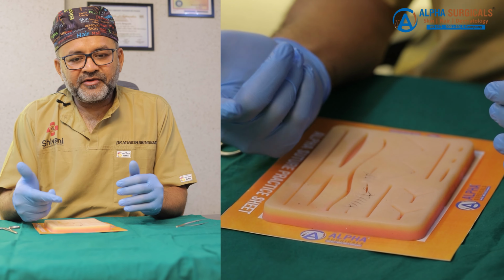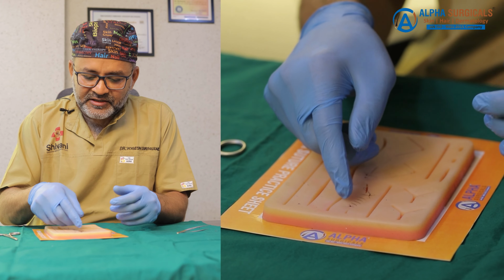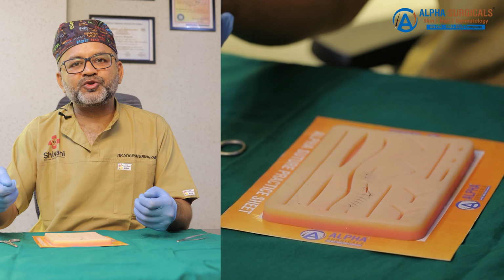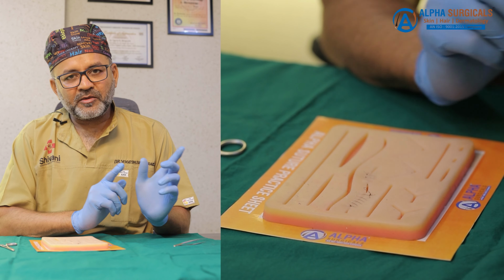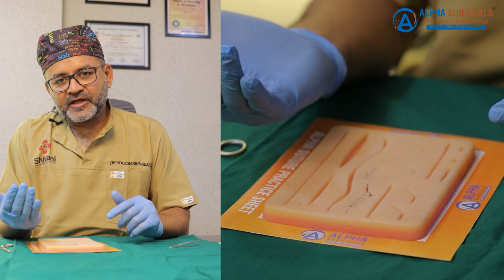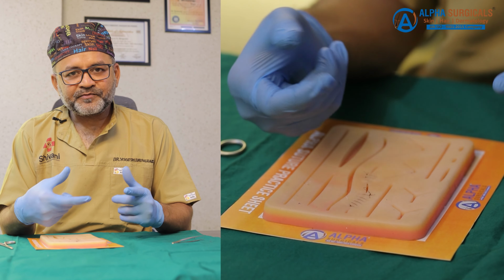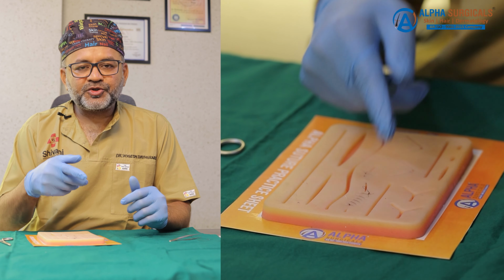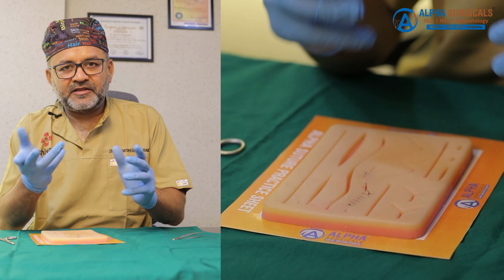The second benefit we are getting is we can adjust the tension created from the suture line at the end of the suturing, and that is not possible in the case of simple interrupted suture. So in those areas where the skin is thin and not much tension is required, the running continuous suture is more beneficial by these benefits.